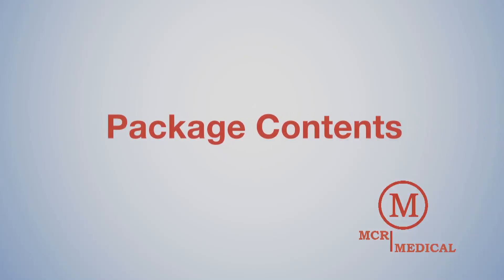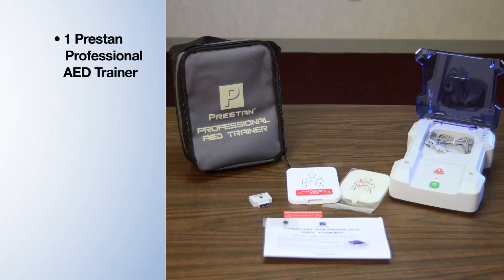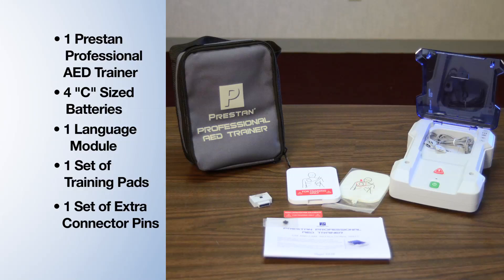Package Contents. Unpack your new trainer to find: one Preston Professional AED Trainer, four C-size batteries installed, an English-Spanish language module with the 2010 guidelines pre-programmed, one set of adult AED training pads, and one set of extra connector pins — all in a nylon carrying case.